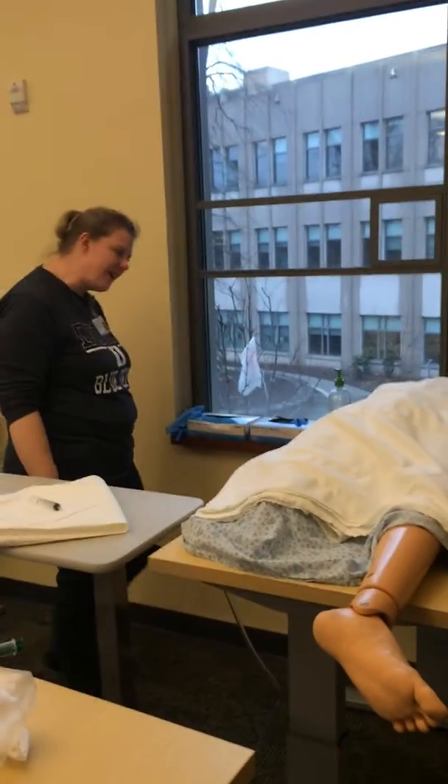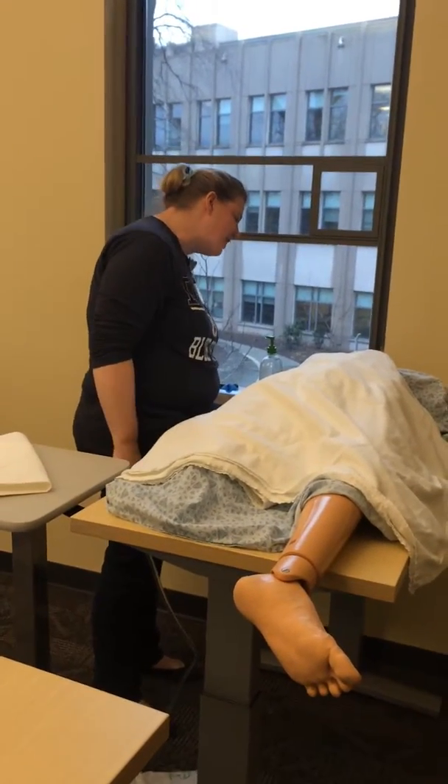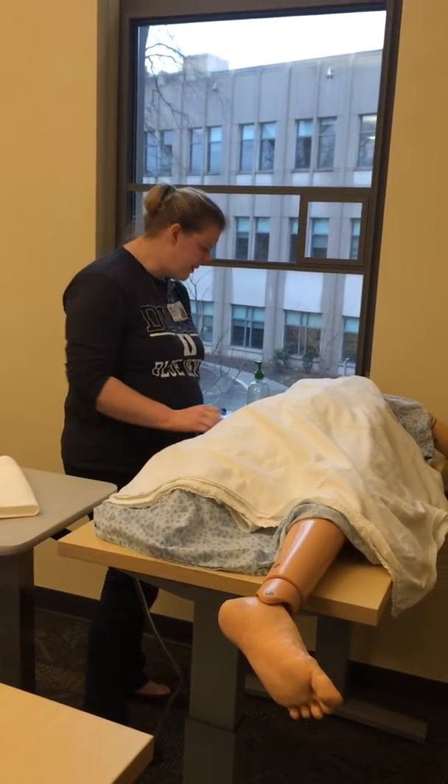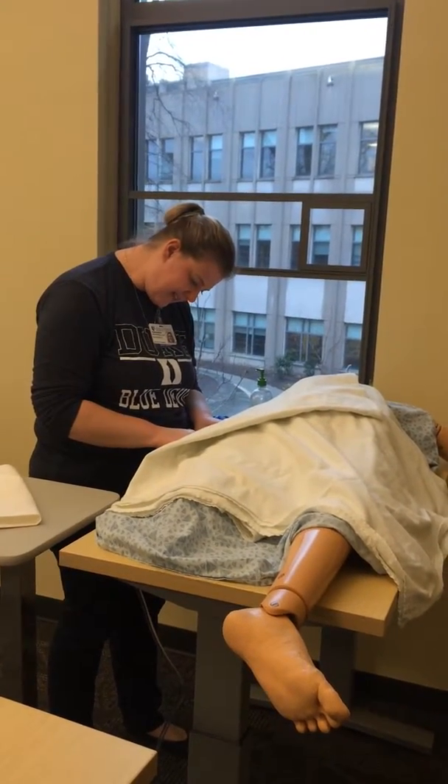Come in. Hi, Ms. Harper. How are you doing today? Great, thank you. Alright. I'm just going to check your wristband and make sure it has your name and date of birth. When were you born? April 20, 1990. Alright, that's you.